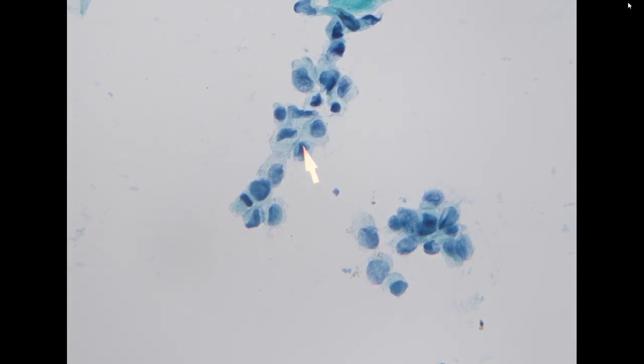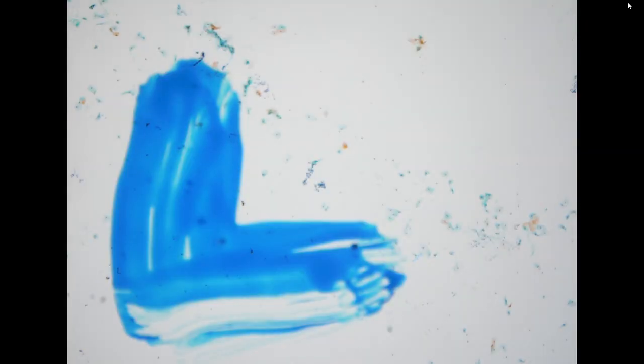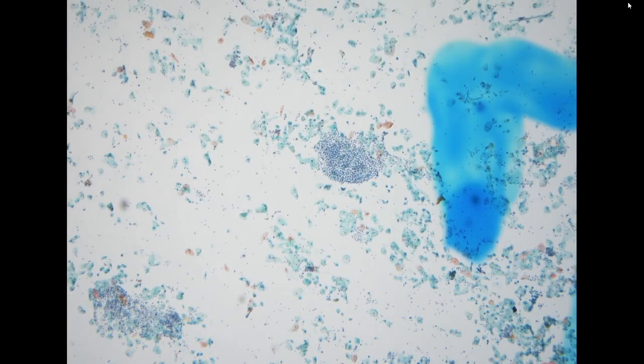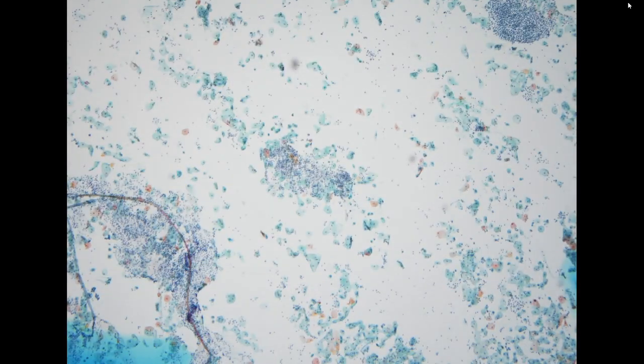In addition, there was an increase of nuclear to cytoplasmic ratio, so increased NC ratio. The nuclear contour seems to be a little bit irregular. Because there are only these spots, our cytotech did a repeat cytospin preparation. This looks much better, much easier for interpretation.